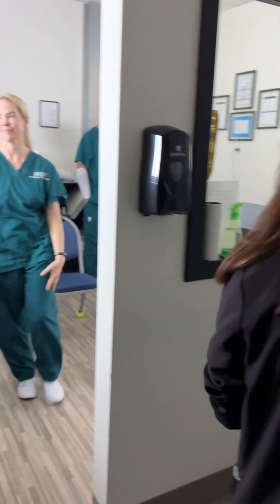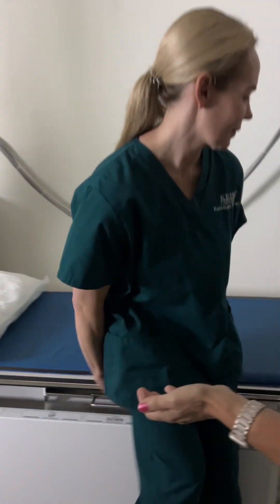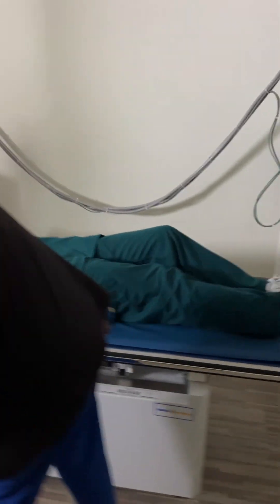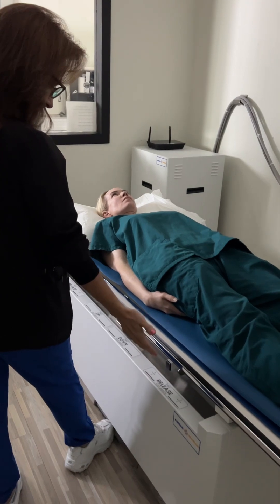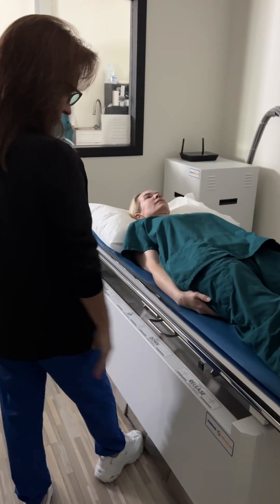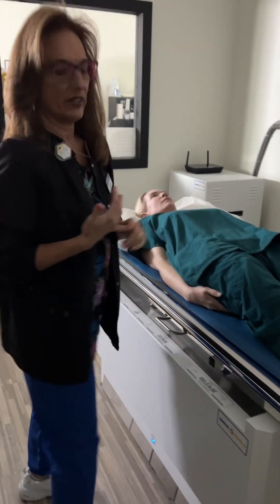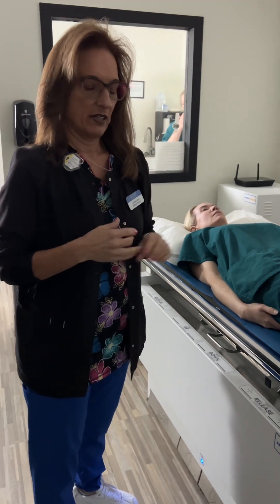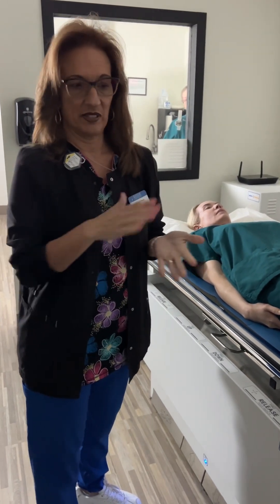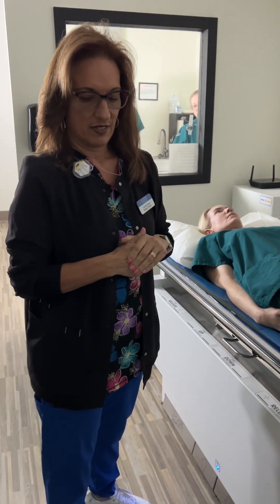Let me get my patient in here. She is already changed — gown open to the back — and we've already completed the history. Along with normal history, we have to add three additional questions. One is: do you have a latex allergy? Second: have you had a colonoscopy recently? Because if they did, we have to be concerned about biopsies.